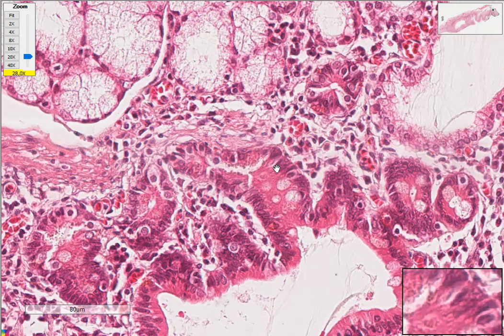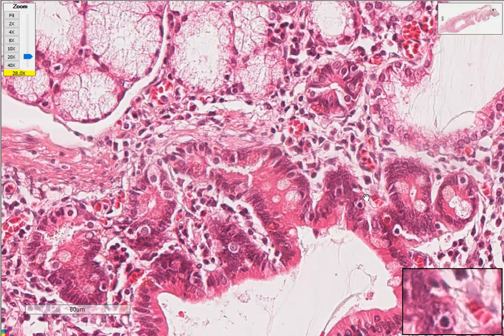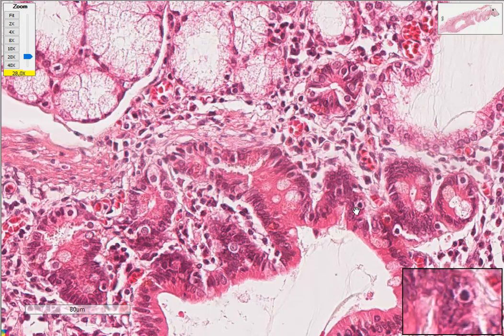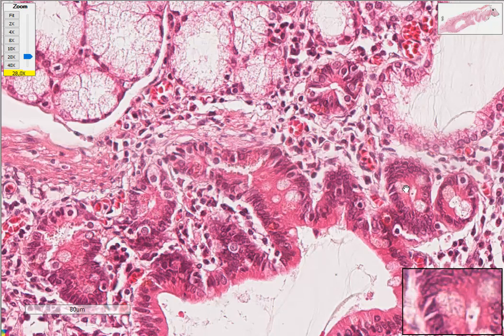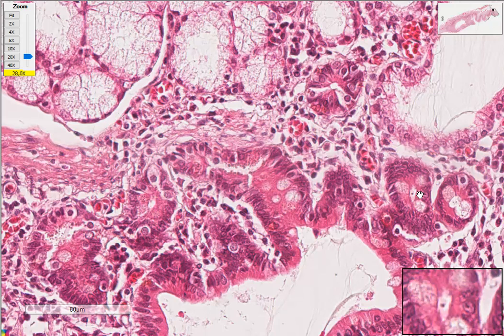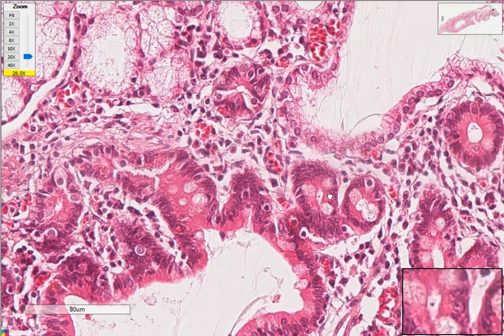Not so clear. And then you also have your enteroendocrine cells. Your enteroendocrine cells stimulate bicarbonate secretion that neutralizes the acid content that comes from the stomach, and they also secrete cholecystokinin, that's CCK, that stimulates pancreatic enzyme and bile release.